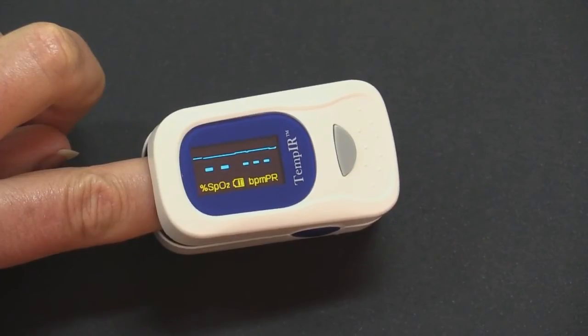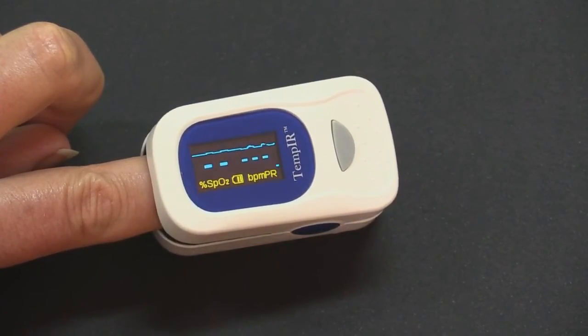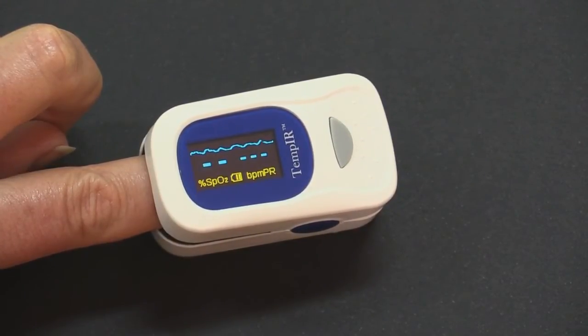The readout will begin. It will take several more seconds before the readout becomes stable. When the unit does become stable, the levels will be displayed numerically.